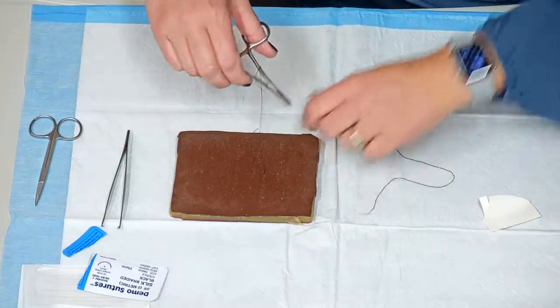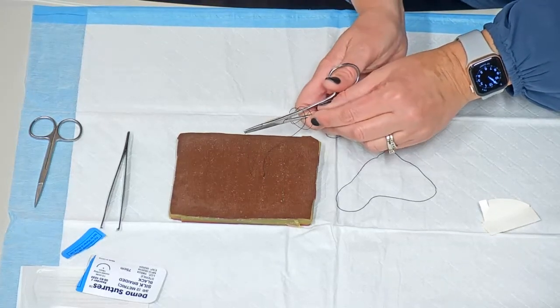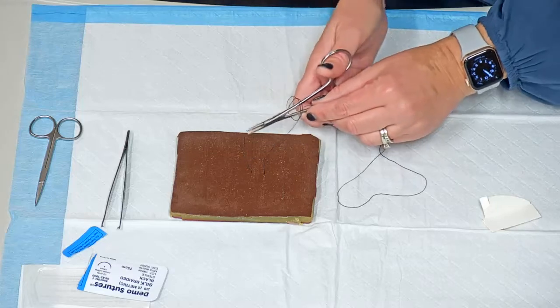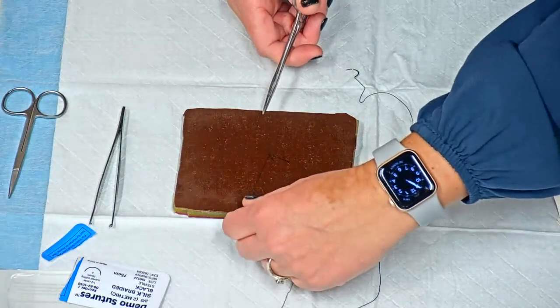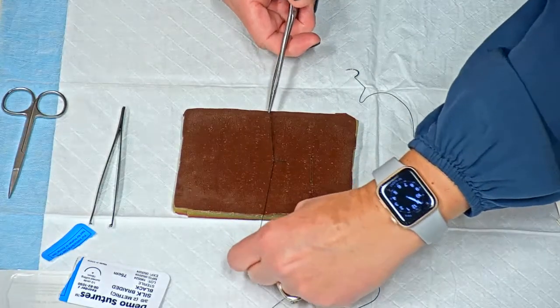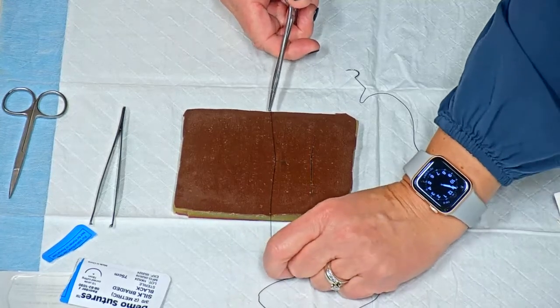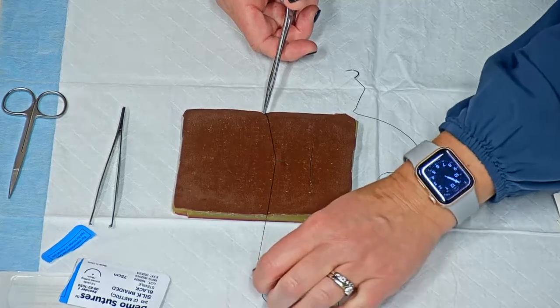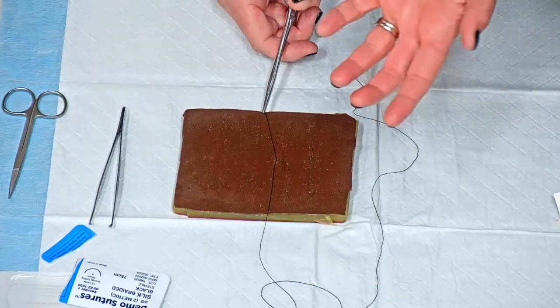So 1, 2. You're going to go ahead and grab the very tip of that tail. You don't want to grab it in the middle because it's really hard to pull through. So go ahead and grab the tip. You'll pull it through. With the one hand, I'm pushing away, and with the hemostat pulling towards me. Obviously, this isn't real skin, but it's a reasonable approximation. And so what you want to do is, when are you tight enough?